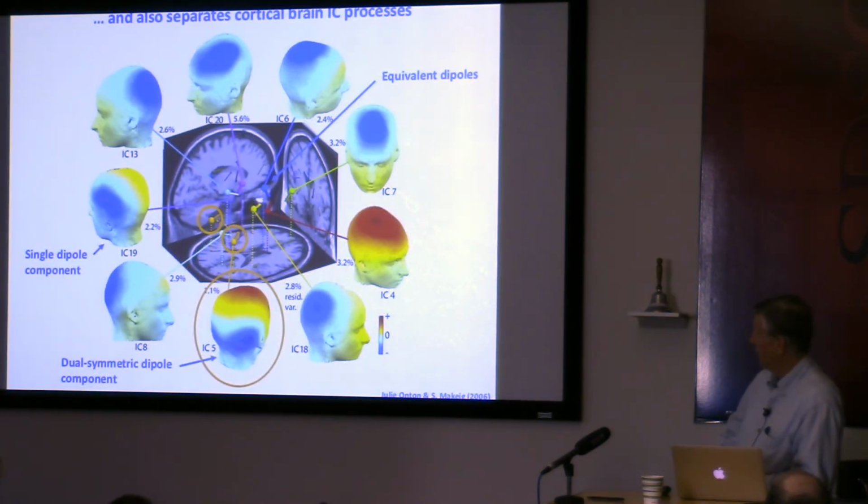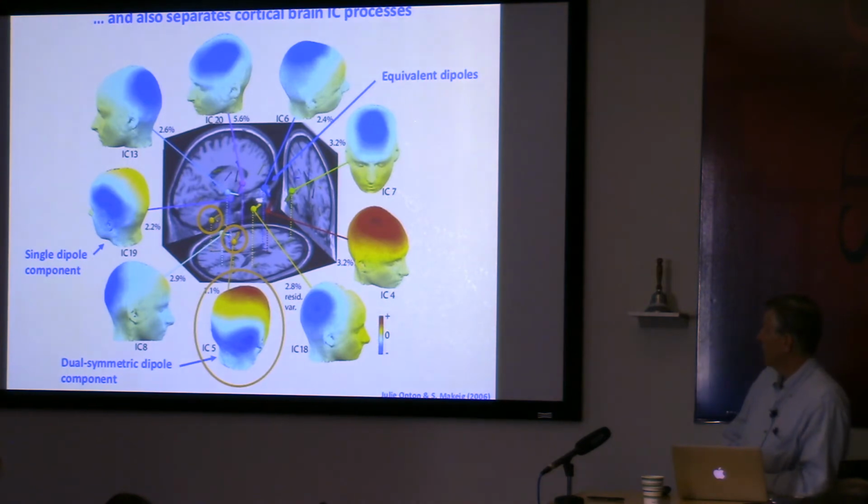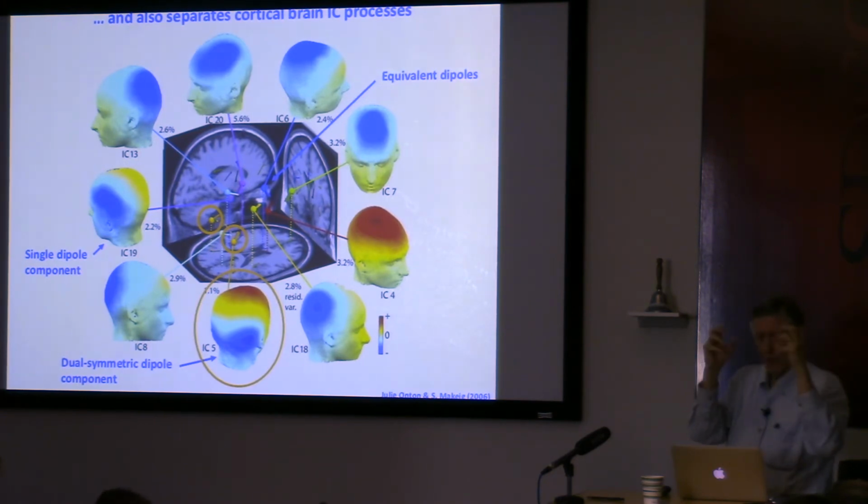Sometimes you find bilateral components, and we've used this one a lot in these slides. It's not found in every experiment or in everyone. And here, again, it can be accounted for almost perfectly, 1% residual variance, with a two-dipole model, the dipoles located bilaterally, as if they might be connected by parallel visual projections or by the bidirectional corpus callosum.